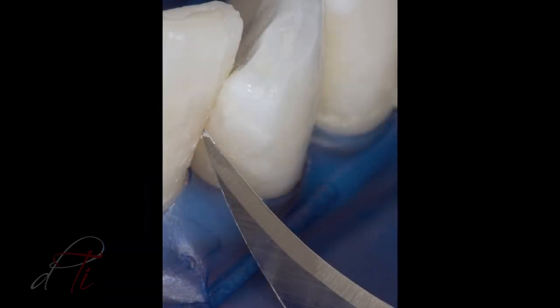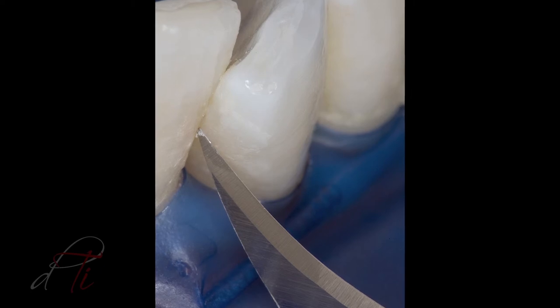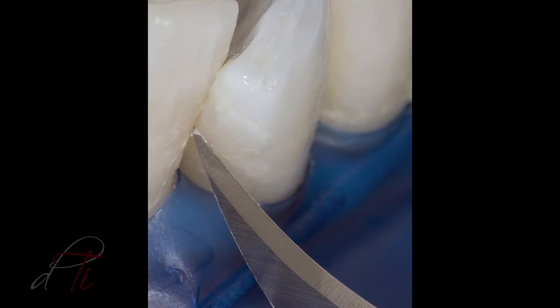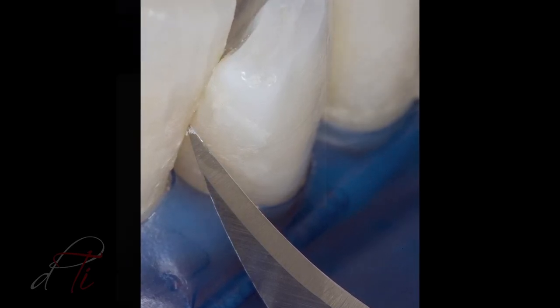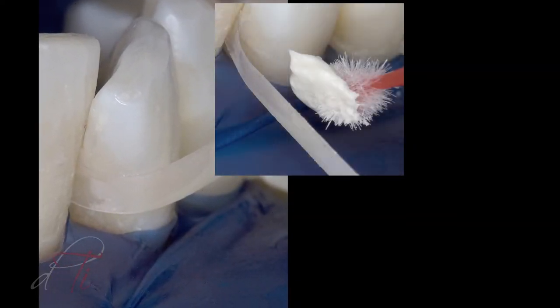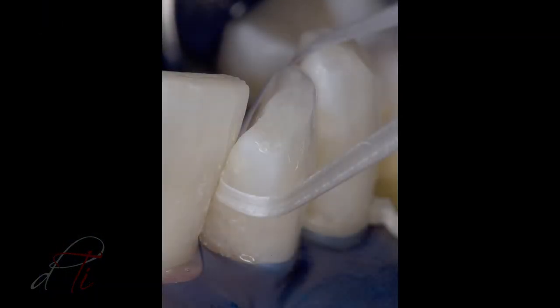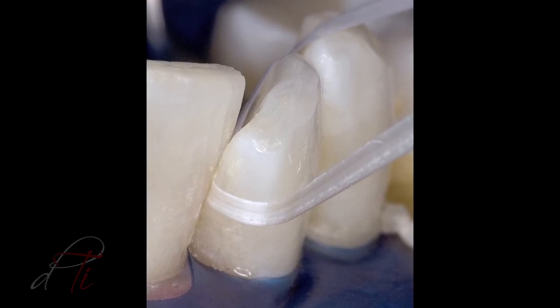The mylar strip was removed and the interproximal region was inspected for any residual composite resin tags or overhangs. The excess residual resin was removed with a surgical blade, a No. 12 BD Bard Parker by BD Medical. The proximal surfaces were cleaned and smoothed with a loose abrasive diamond polishing paste, carried into the interproximal region with finishing strips using the ET composite polishing system by Brassler USA. The proximal surface was inspected for adequate contact with unwaxed floss prior to removing the dental dam.